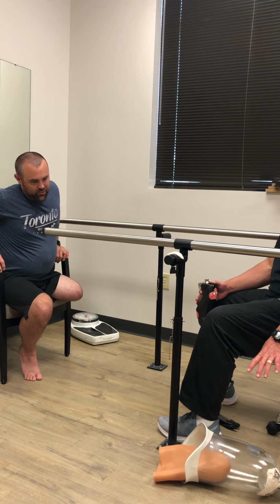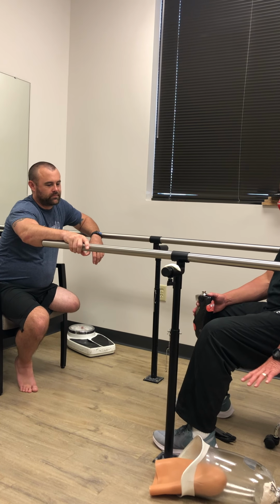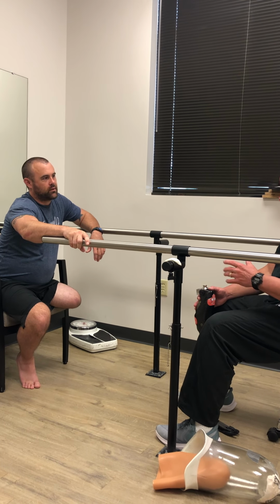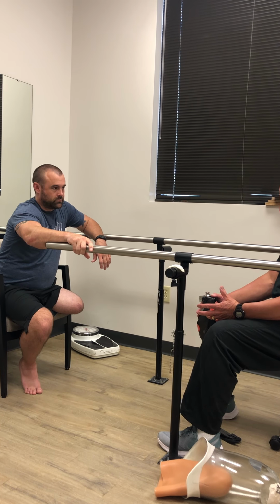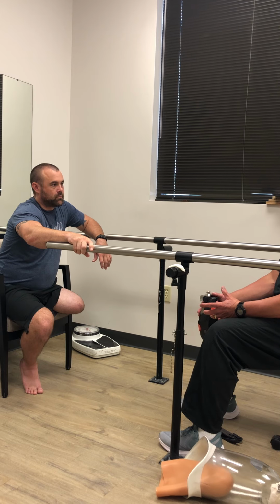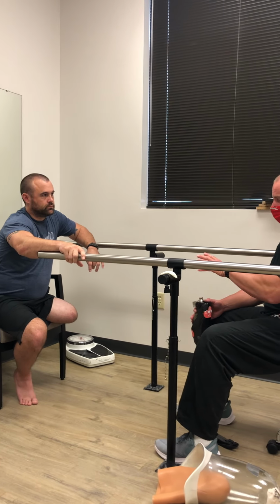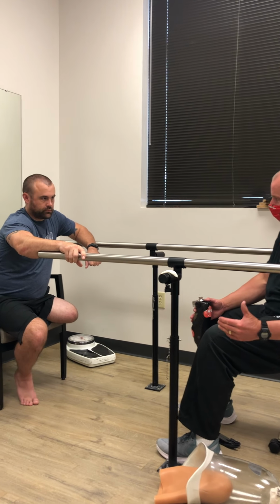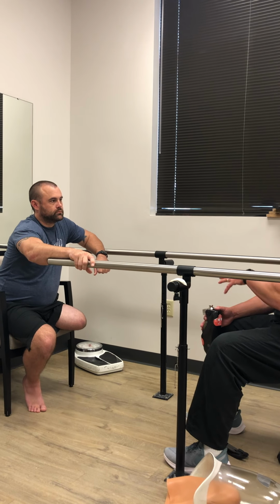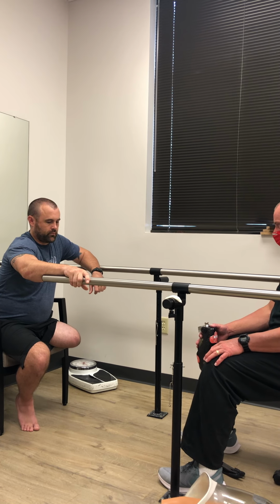This system that you've got is going to hold about as good as any system out there. Unless you have a massive change, which, in 6, 9 months, I don't know how fast you're gonna shrink. Could we be looking at another socket? Maybe. But I don't think with you there'll be some duration in there. By that time, you'll know that something's changing. If you look at your limb, you know if it's getting skinnier or not. It's not rocket science.